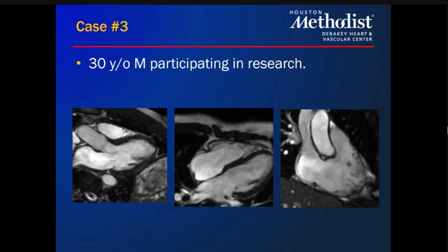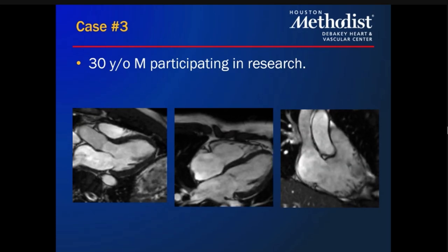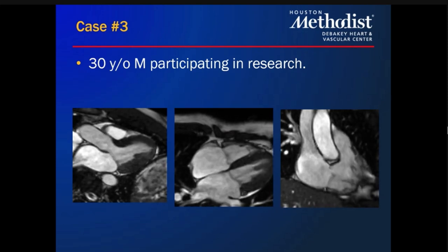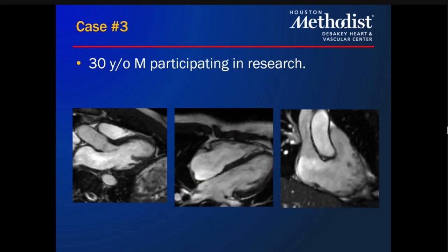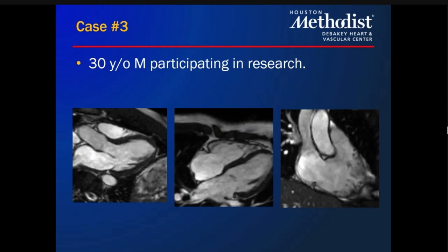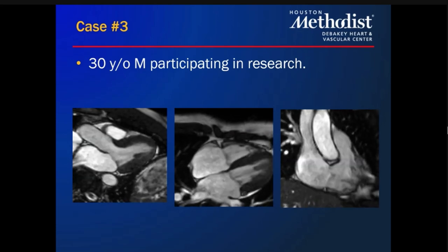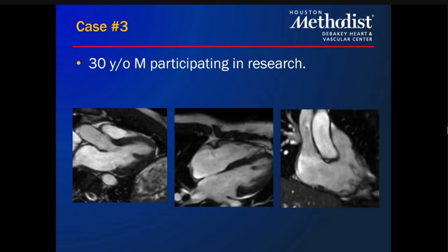Yeah, so this particular volunteer was like you, George. He works out a lot, actually does a lot of running, cardio, and absolutely, his heart rates were in the 50s. The chambers did come out dilated, but everything came out normal function, no issues whatsoever. But this comes up again and again as to whether or not we're dealing with someone with a pathologic enlargement of the different chamber sizes, right ventricle and RA included. These patients show up in our CMR lab, and we go through all this, look at their clinical history, and have to comment on whether or not we're dealing with an athlete's heart or not.